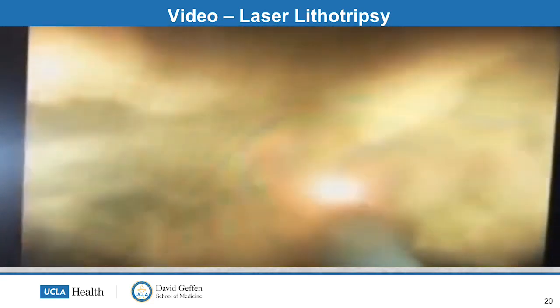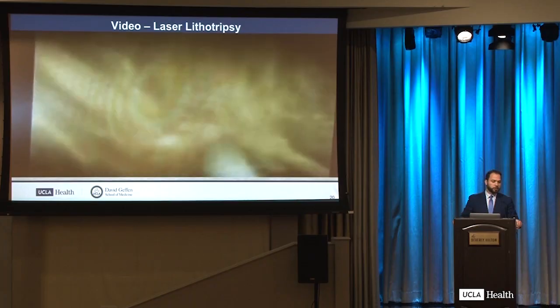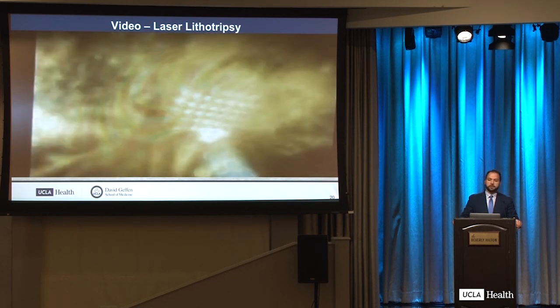After you do that, we usually use 10 watts, and mostly it's effective, and if it doesn't work, we can go up to 12 watts of energy, and that will help fragment the stone. After that, we use the balloon to sweep those fragments out and clear the duct.